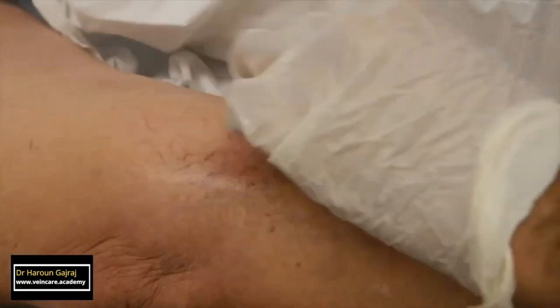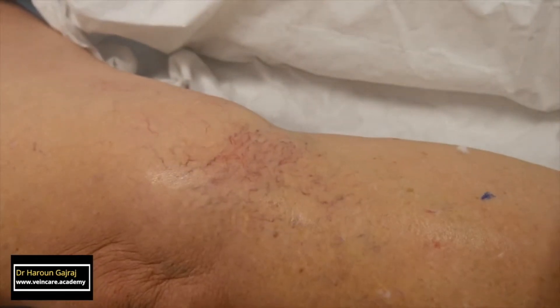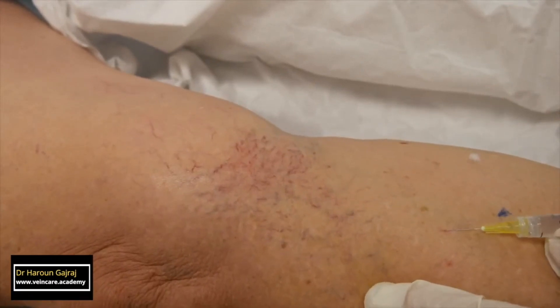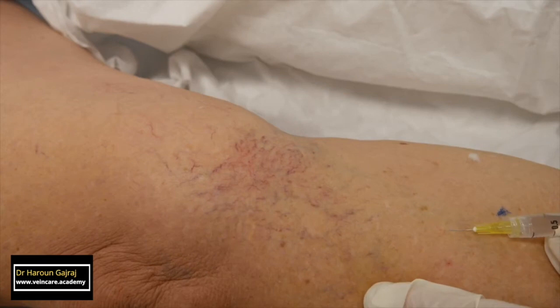Although the appearance is very dramatic, I avoid the temptation to cause blanching over a large area. It's much better to inject several small sites with small volumes of sclerosant.